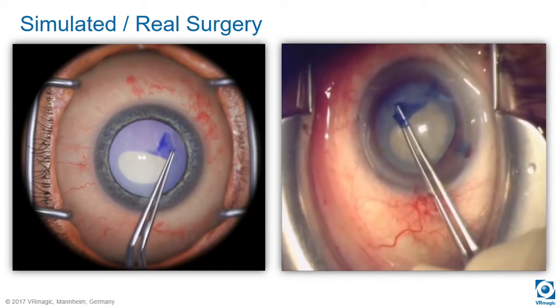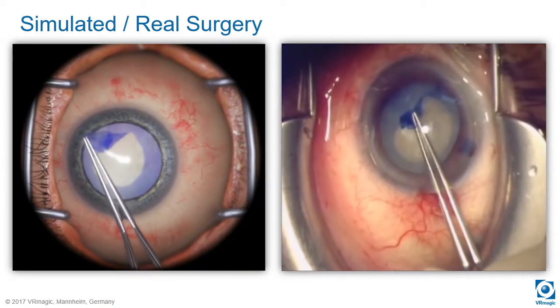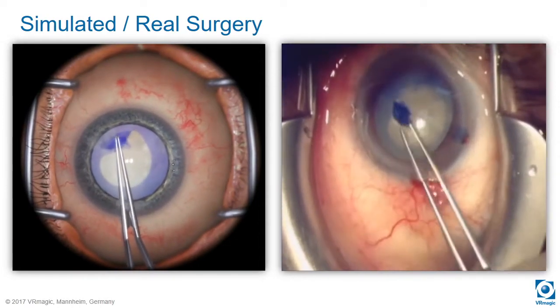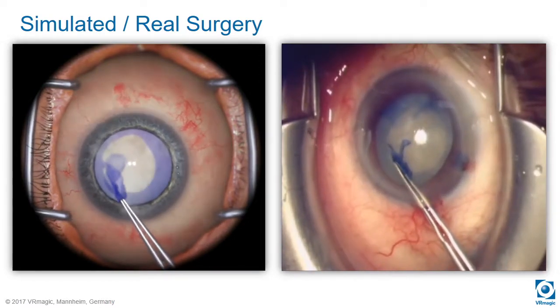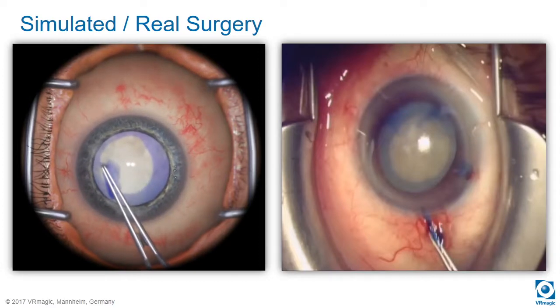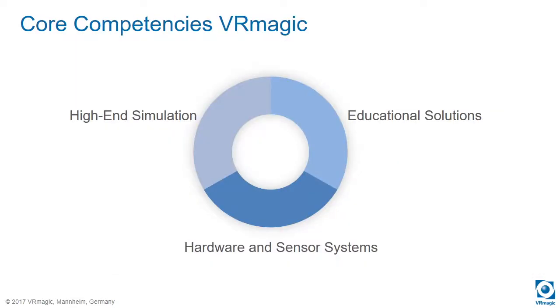It won't be identical. That's not our aim. We don't load patient-specific data into the simulator, but we have generic patients. But it's close enough to provide for an efficient training. Yeah, this opening is not perfectly round. It's a bit decentrated. This one is more in the center, but also not perfect. Both surgeons, I think, can still improve a bit on their technique.